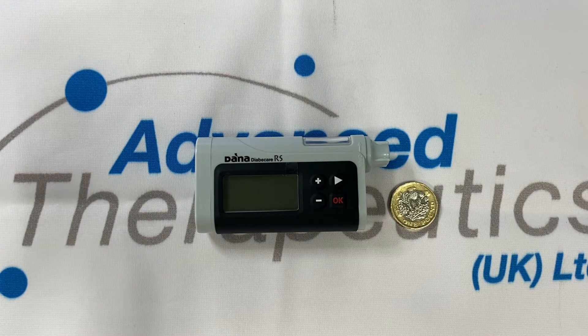It's packed full of features with a bolus calculator allowing you to deliver instant, extended or dual pattern boluses, a minimum basal rate delivery of 0.04 units an hour and increments of 0.01, four basal rate profiles available to program, and temporary basal rates ranging from 0 to 24 hours and 0 to 200 percent delivery.